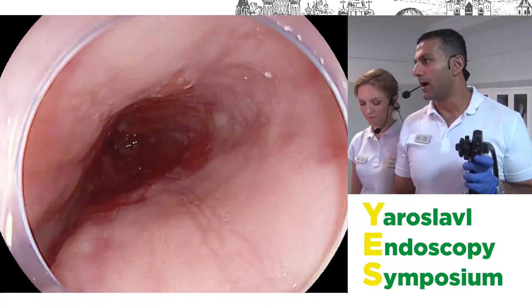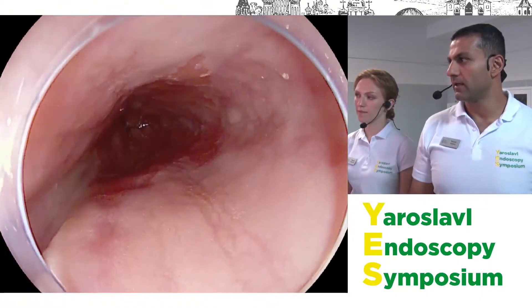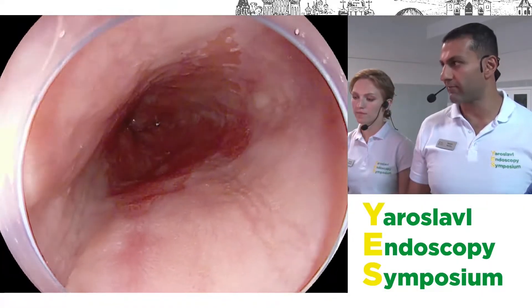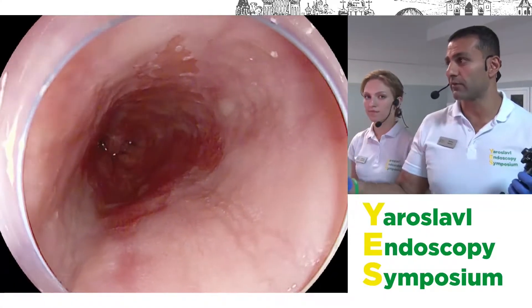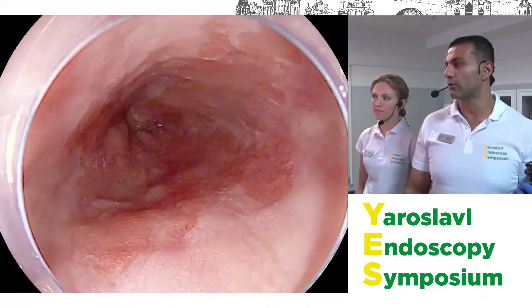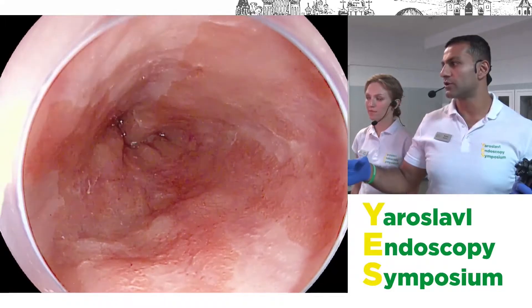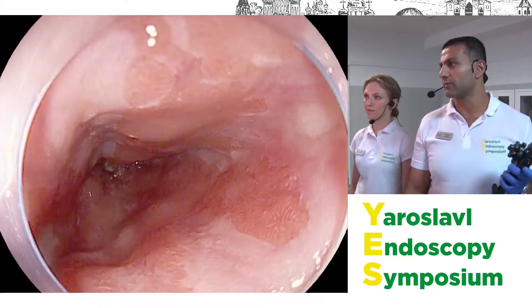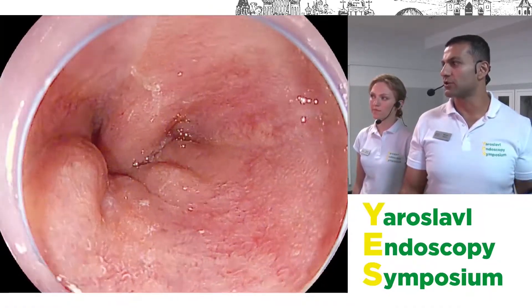Combining the optical enhancement with the magnification function is really fantastic for looking for micro-dysplasia, which can inform your decision-making. Before we get to the clever optics and therapy, I want to focus on some basics of Barrett's nomenclature. Here I'm using the iScan1 mode, which gives a lot of contrast enhancement when you freeze the image.